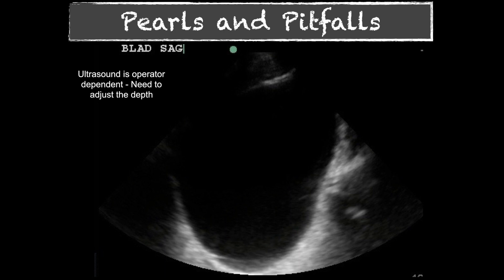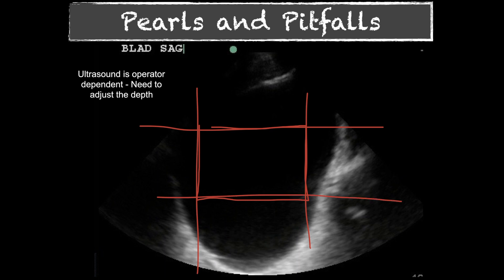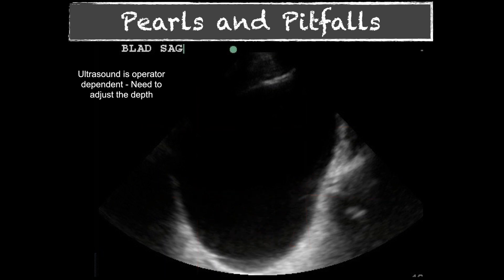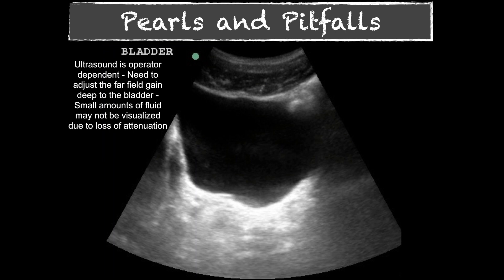Another common mistake is setting the depth too shallow when evaluating the bladder. The area of interest should be in the middle third of the image horizontally and vertically, with the back of the bladder wall positioned there so you can see posterior to it and detect any fluid. If the bladder wall is at the very bottom of the screen, there's no way to determine if there's free fluid beyond it.